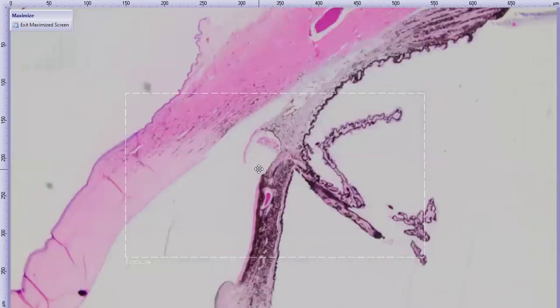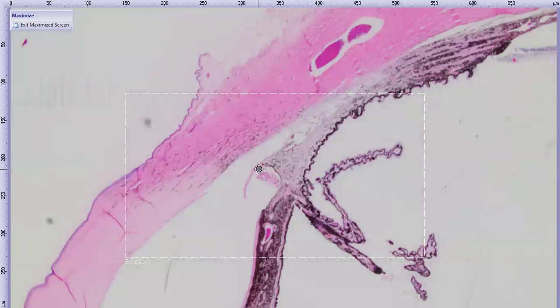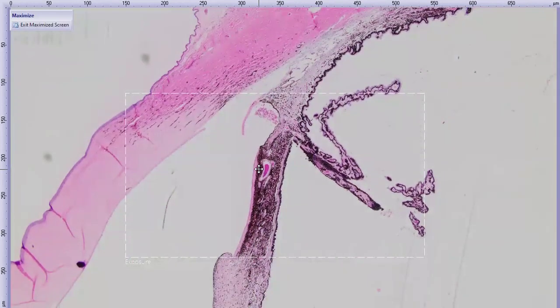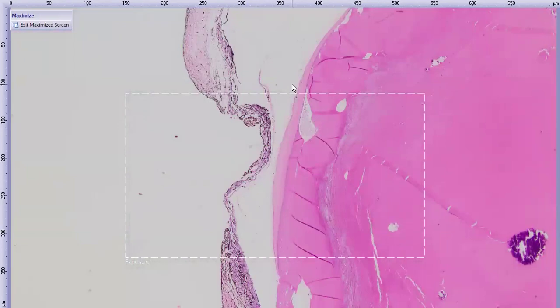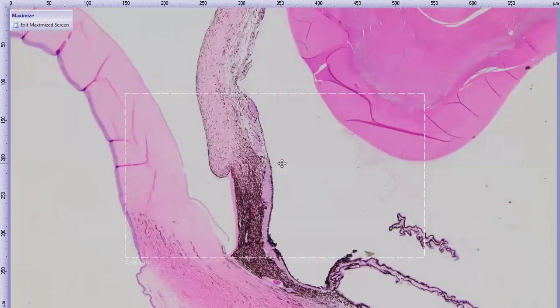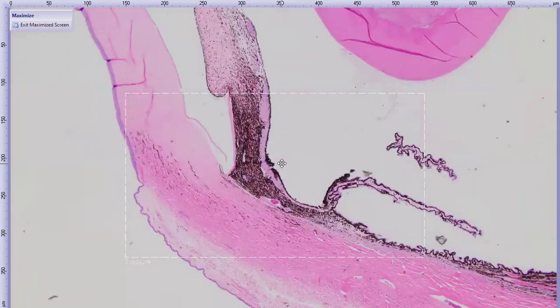So no mass effect seen grossly, no evidence of neoplasia seen histologically, particularly at this point. What we do have is this very darkly pigmented peripheral iris, and there's this bright pink, very solid layer of stuff on the surface of the iris there. As we come across here, there is this wispy membrane right here on the back of the iris, close to the pupil, which is probably causing that posterior synechia, which means that the pupil wouldn't be quite as responsive if it was firmly adhered to the lens capsule.